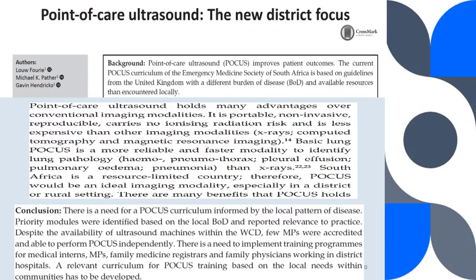It basically explores that POCUS has a lot of advantages: it's portable, it's non-invasive, you can reproduce whatever you've scanned, there's no ionizing radiation, it's less expensive, and it's more reliable than some of the other imaging modalities, especially if we are relying on chest x-rays for diagnosing pleural effusions. And it's ideal for resource-limited areas.